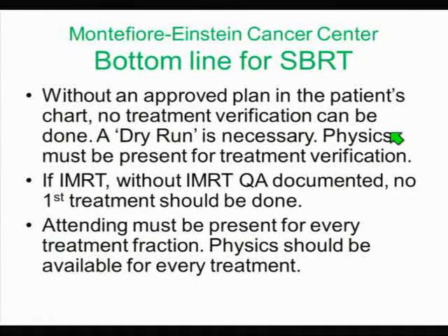The bottom line for SBRT at our institution is, without an approved plan in the patient's chart, no treatment verification can be done. A dry run is necessary. Physics must be present for treatment verification. If there's IMRT involved, without IMRT QA documented, no first treatment should be done. And the attending must be present for every treatment fraction. Physics should be available for every treatment.